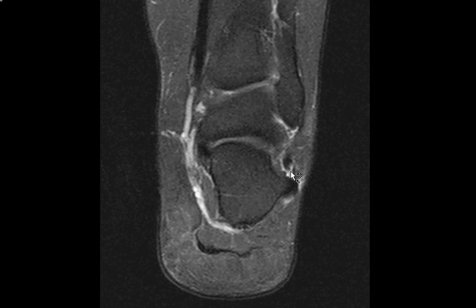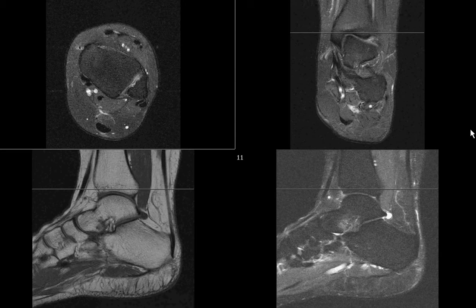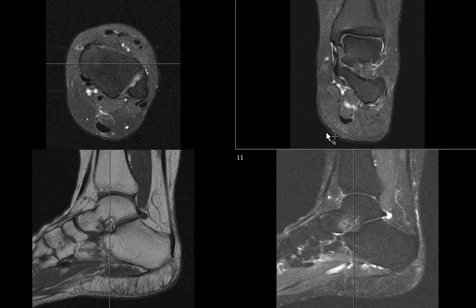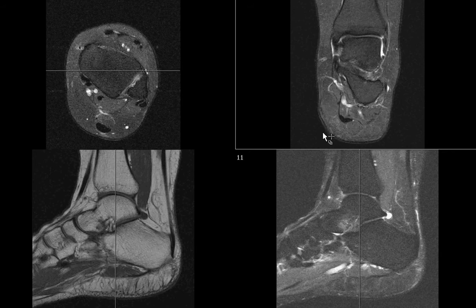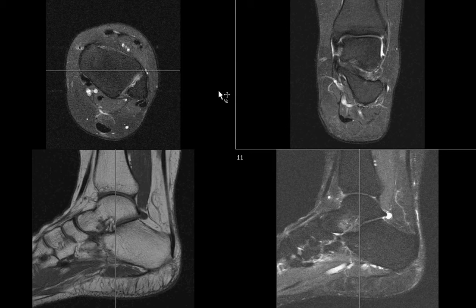As you look at the cut lines and I scroll through these coronal images, you notice that the cut line is a straight horizontal line that's parallel to the imaging table, and that's not what you want to do with musculoskeletal imaging.